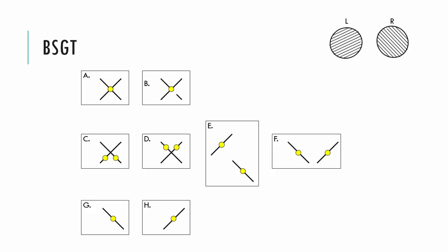Patients are unlikely to volunteer this, so you need to ask that question of your patients to actually hunt for central suppression. I found that the younger the individual is, generally young children, even if there is central suppression, it's very difficult for them to look for it or articulate or understand the question that you're asking of them.